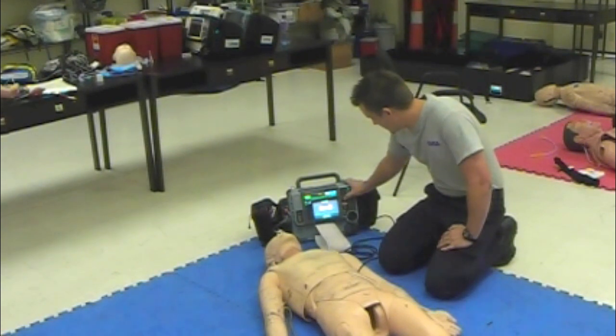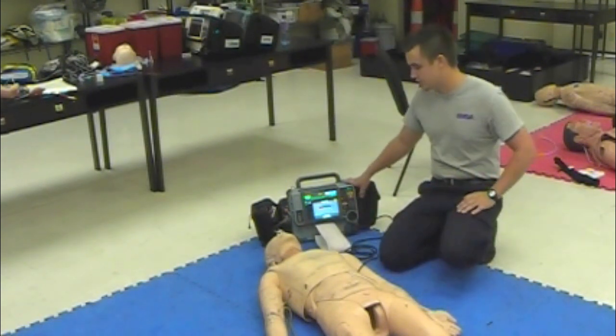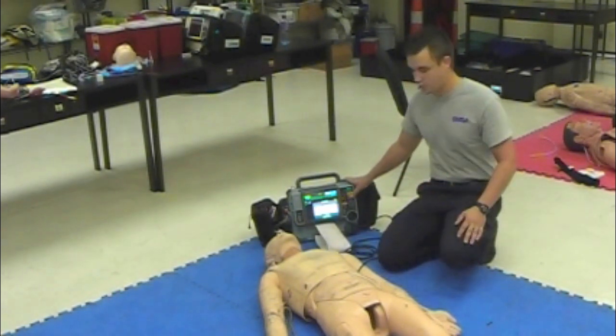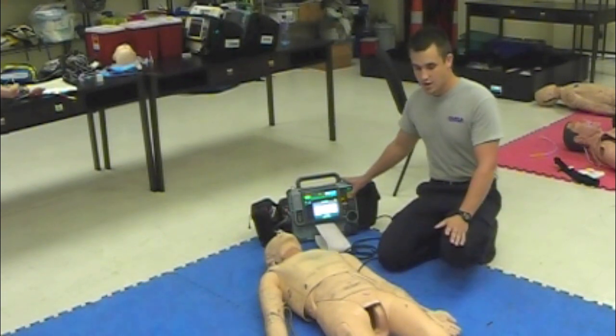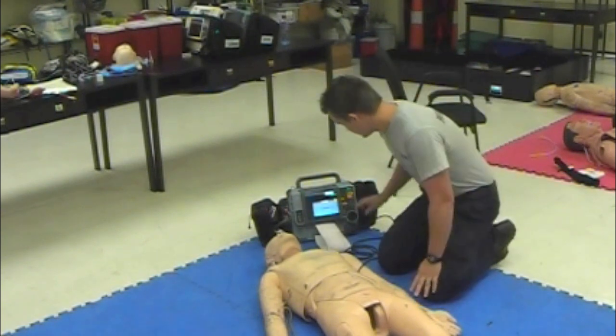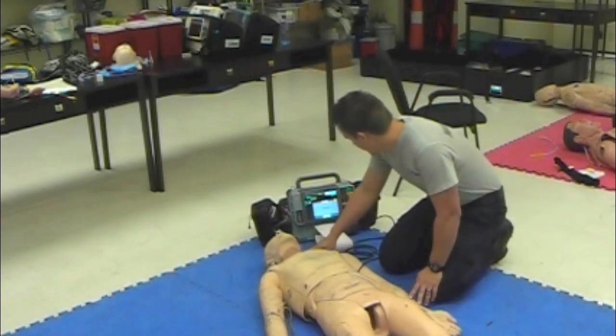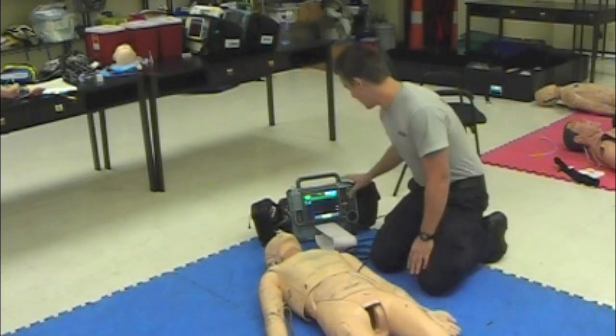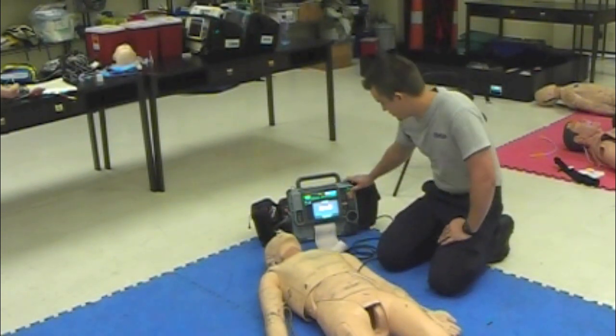And I'm also going to sync this. And still giving ventilations as I charge it up. Okay, we're ready for a shock, off ventilation, so I'm going to watch my patient, make sure no one's touching it. I'm going to shock on 3, ready, 1, 2, and 3. Shock delivered. And do I still have a pulse with this? Yes. Okay, it's VTAC. So continue ventilations, I'm going to charge it up to 360.